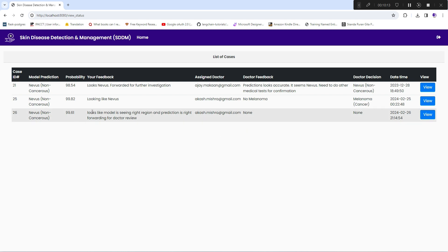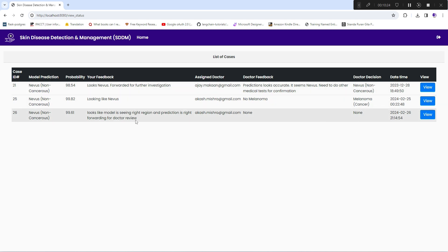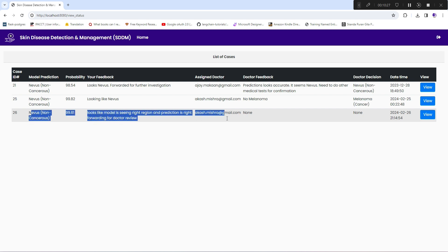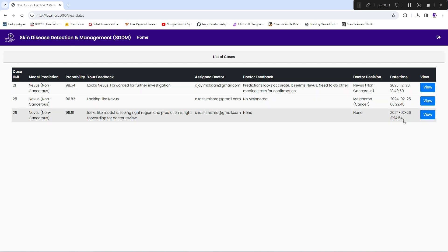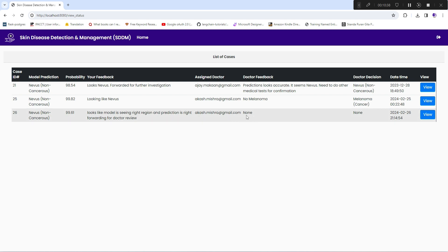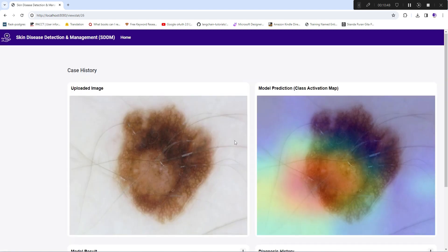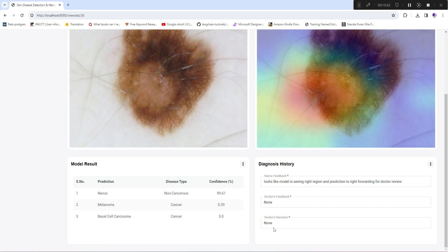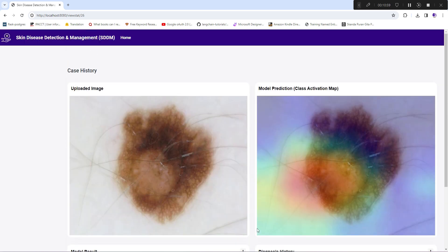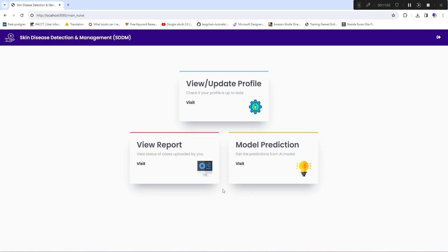The view report section shows the status of all cases the nurse has handled. She can see the latest case where there is no doctor feedback or doctor's decision yet, and she can follow up with the doctor directly. She can also click to view a case and see the same prediction view. Once the doctor updates it, she can see the doctor's feedback and final decision.